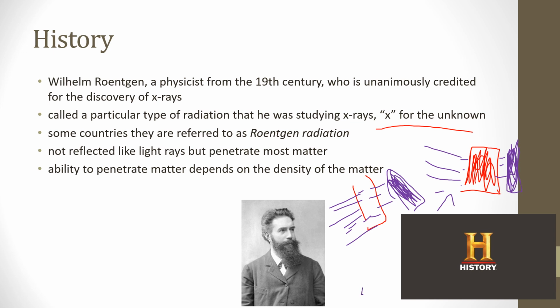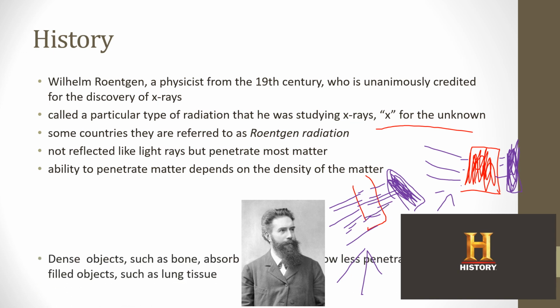Over here, in this lower scenario where we have the hollow brick, there's less absorption of the X-rays by the material, and therefore most of the X-rays will hit, and therefore it's going to appear more radiolucent or dark.